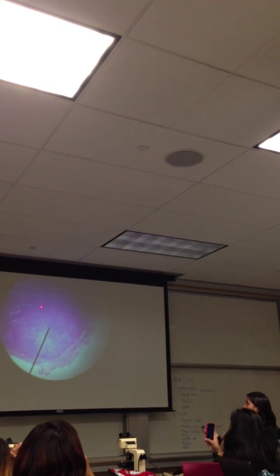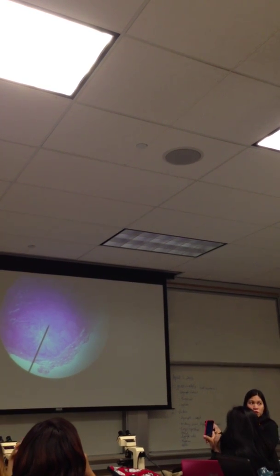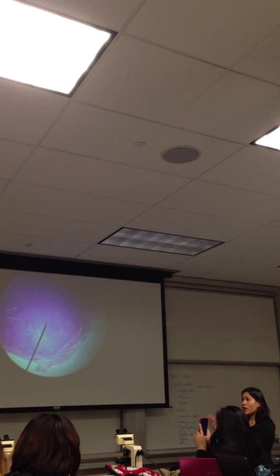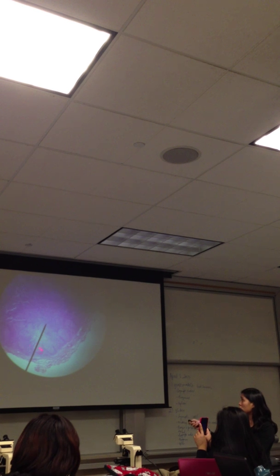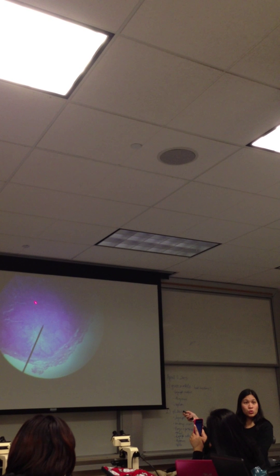Do you remember this? You should not confuse this with this. See how this is loose, as we mentioned? This is more tightly packed, and this has a capsule. What is this again? Lymph node, right? Why is this not the spleen? Because it doesn't have the contrast of red and white pulp. It does have some nodules here, but see how it's mostly, remember the cortex and the medulla?